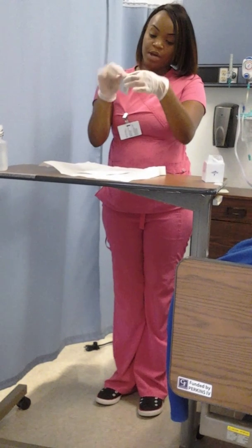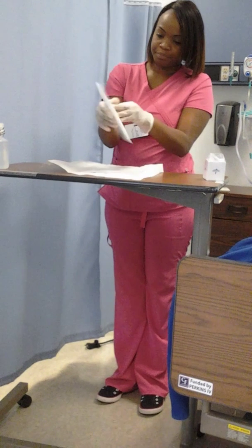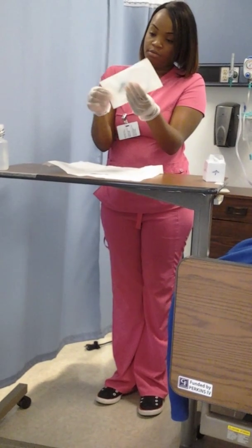While I have two hands, I'll go ahead and open up my lubrication and just put it over here in this small area. Gotta get my catheter out.